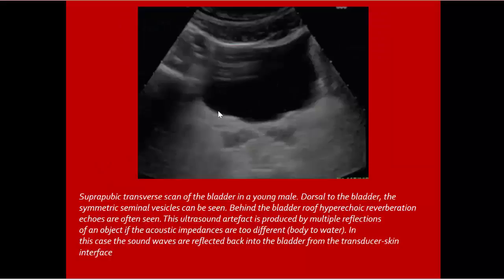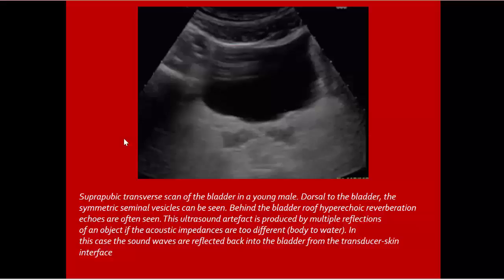Suprapubic scan of the bladder shows dorsal structures, symmetric seminal vesicles. Behind the bladder roof, hyperechoic reverberation echoes are seen. This is an ultrasound artifact produced by multiple reflections between objects of different acoustic impedance, such as body tissue to water. Sound waves are reflected back into the bladder from the transducer-skin interface.